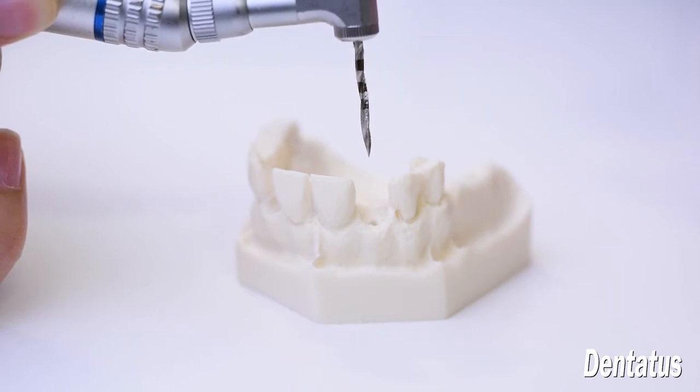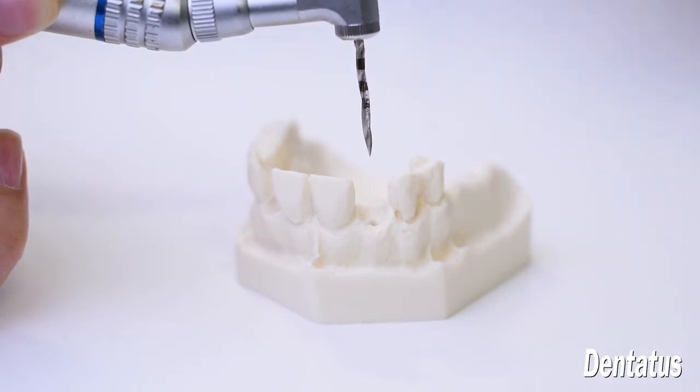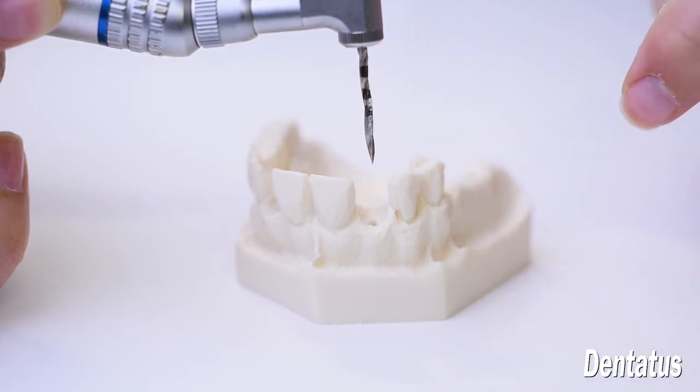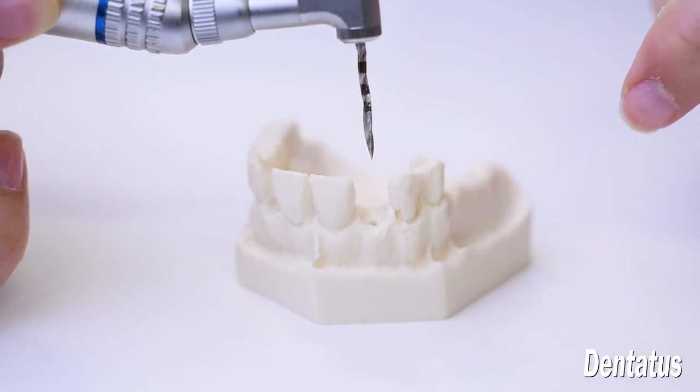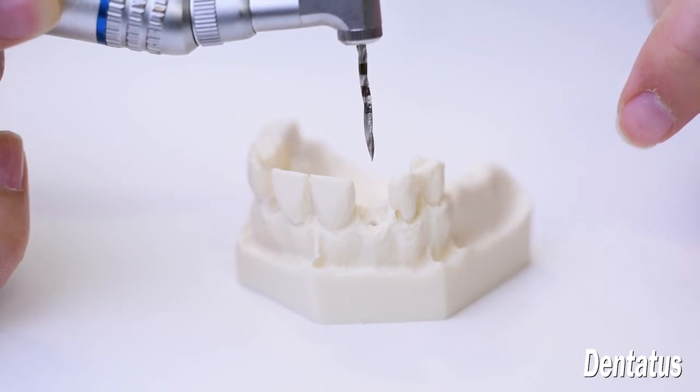The laser-etched markings are easy to read while drilling. The upper border of each marking measures 11, 14, and 18 mm in the System 2 series, which is generally used for flapless surgeries. The System 1 is for flap procedures, and those markings are 7, 10, and 14 mm.